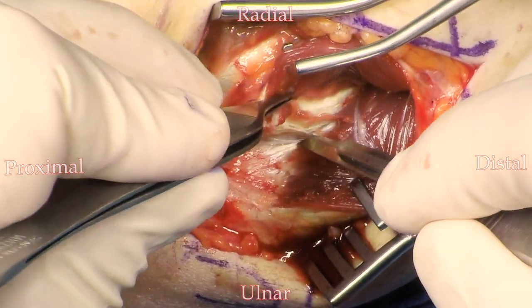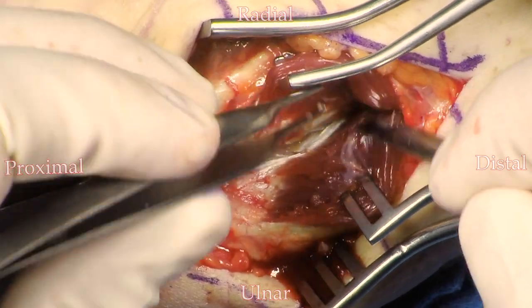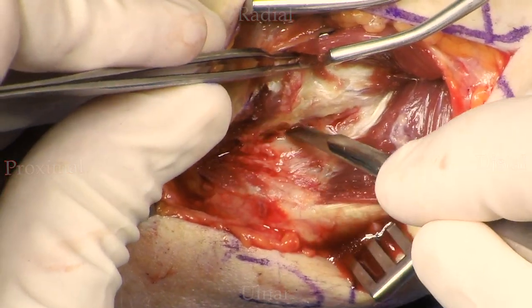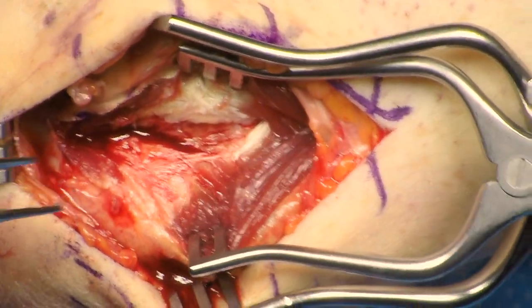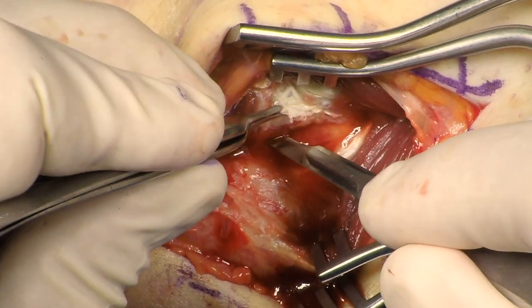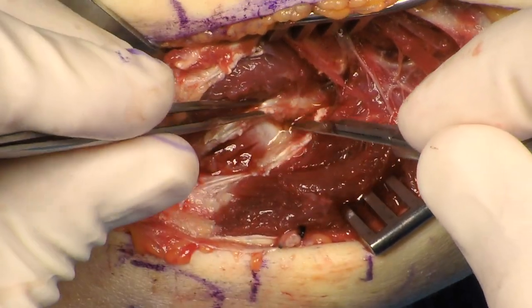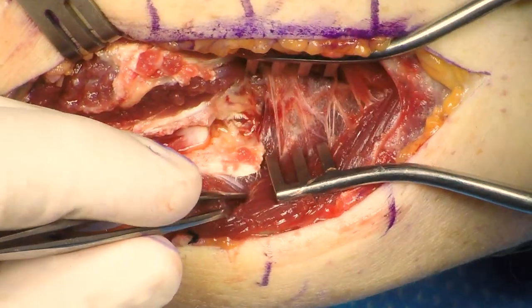Here the flexor pronator mass is being elevated. The capsule can be visualized — right there is the synovium. The trochlea can be visualized. The dissection is then taken distally, and you can elevate some of the anterior capsule to help your exposure. The dissection is taken onto the coronoid.